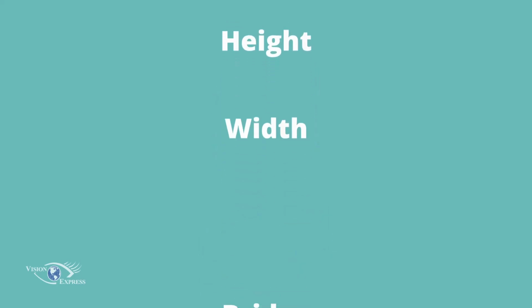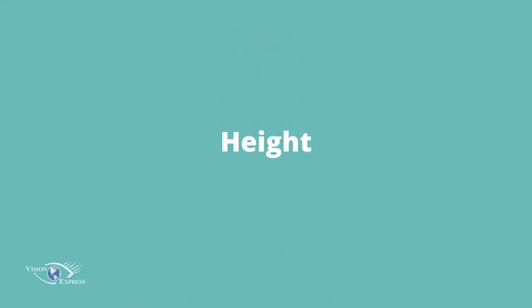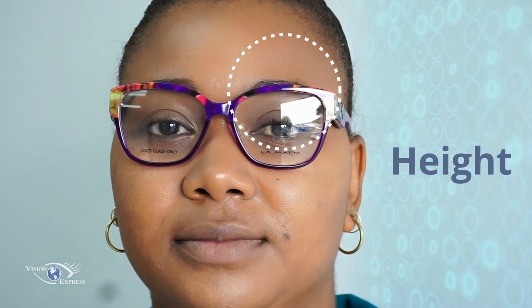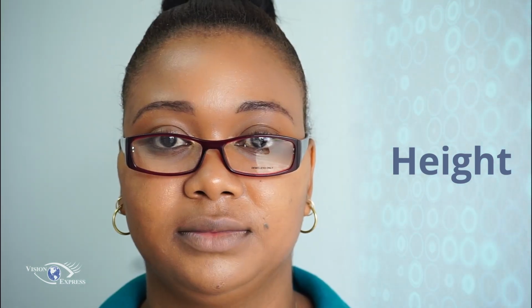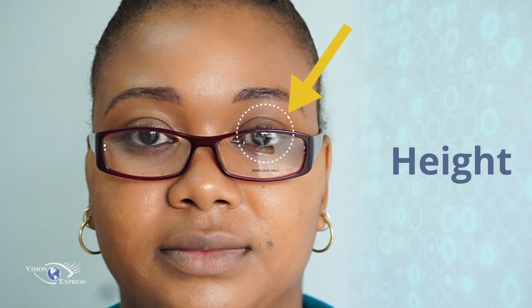These are the 5 most important areas to pay attention to when fitting a pair of frames. The height. The frame should not cover the eyebrows. The frame should not lie across the patient's upper lid. This can cause the patient to look over the frame rather than through them.